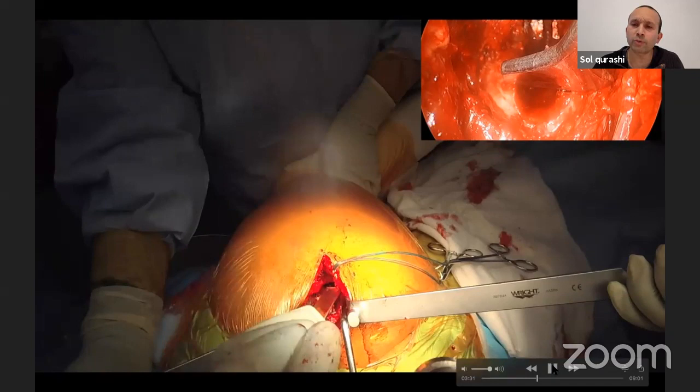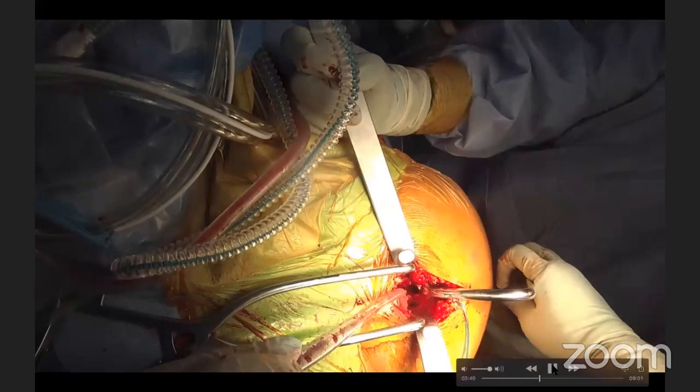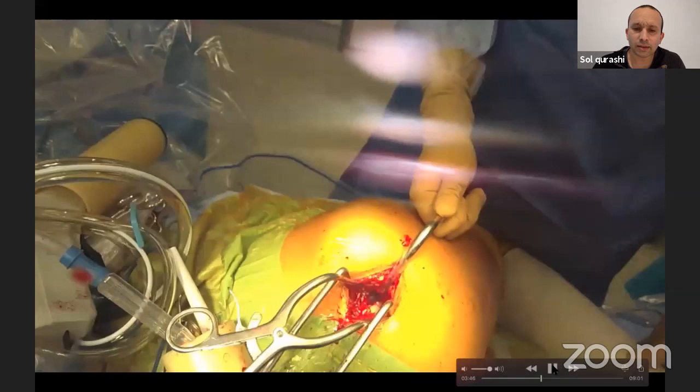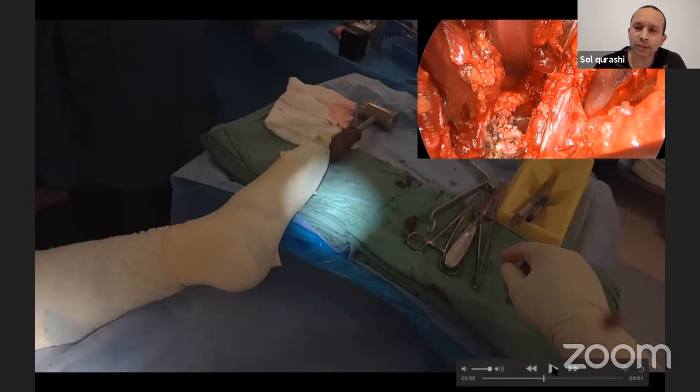The head comes out in a few pieces. It makes life a lot easier. So once the head, that's the wedge, and then you drill these pins into the head, you get a good bite of the head, and the head usually comes out like so. Now, I'm just going to check to make sure I haven't destroyed anything.